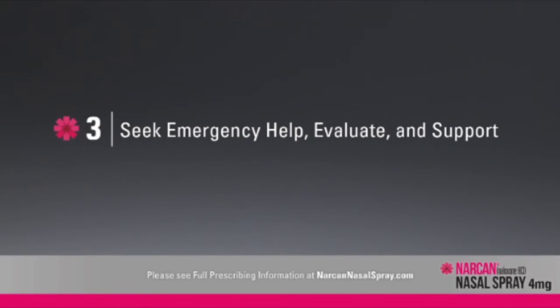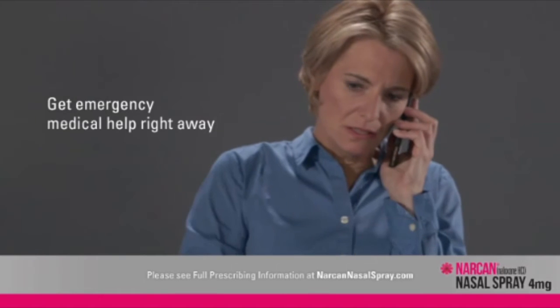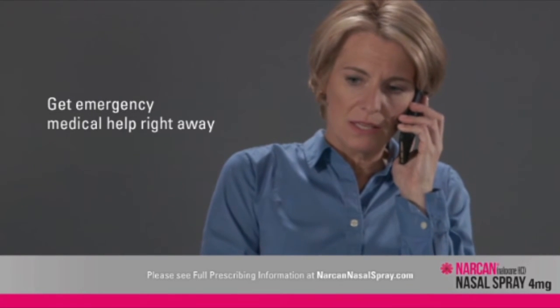After you have given this medication, seek emergency help right away. Narcan nasal spray is not a substitute for emergency medical care.